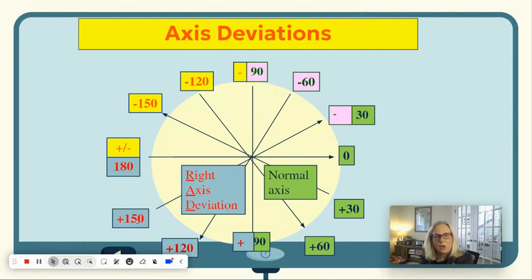Okay, so the next one is called the right axis deviation. That means if it ends up pointing a little bit this direction instead of this direction, it's pointing more towards the right. Remember, this is the patient's right. It doesn't make it extreme or crazy or anything like that, but it just means it's kind of pushed a little to the right. And sometimes there's a tumor in there pushing it. Again, pregnant women have stuff get squished all over the place in different angles. It's not going to do anything wrong to the heart. It's not going to make it bad. A right axis deviation is usually nothing to worry about. The apex is still down below.